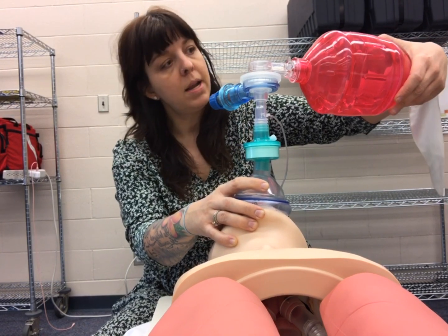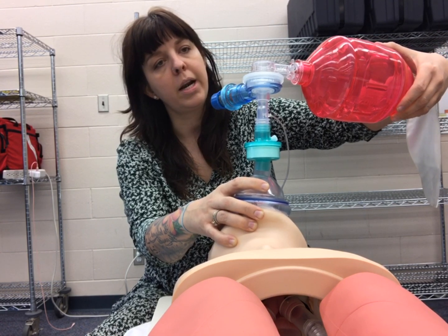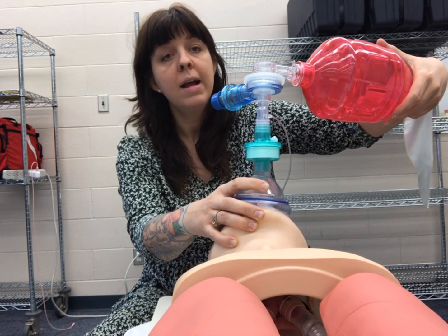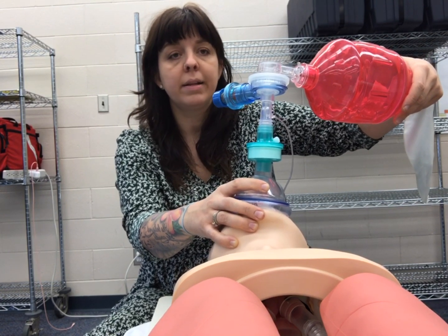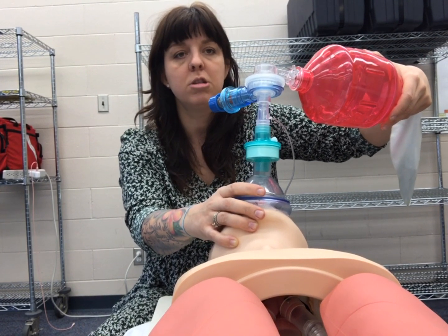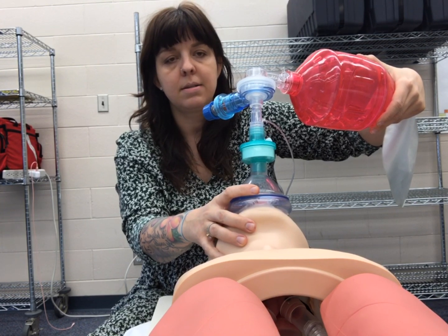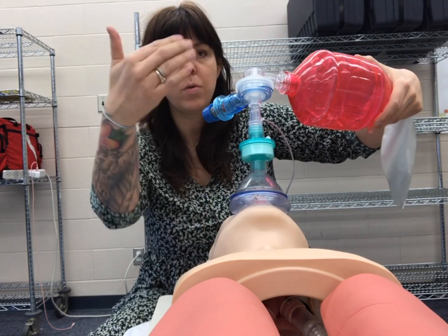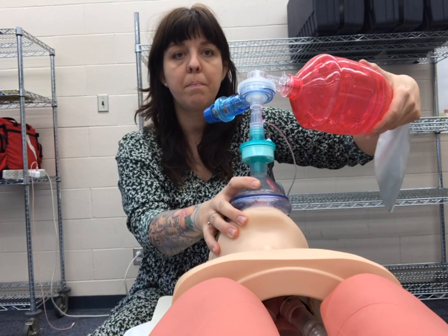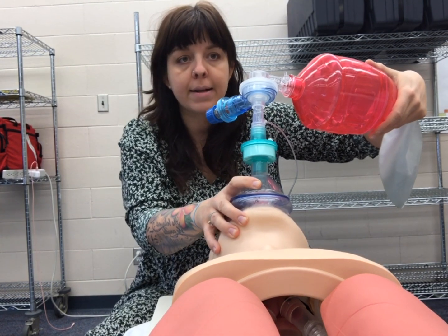We begin ventilations — one breath every five seconds. My ventilation goes in for one second and I let the patient breathe out for four: one, two, three, four, five. I do this for three or four breaths, then delegate someone to get an SpO2 and ETCO2. In this scenario — a heroin overdose — the patient's SpO2 is 66%. That is not okay. What I'm doing is good but not enough, so we need to progress to improve oxygenation to the brain, heart, lungs, and kidneys.